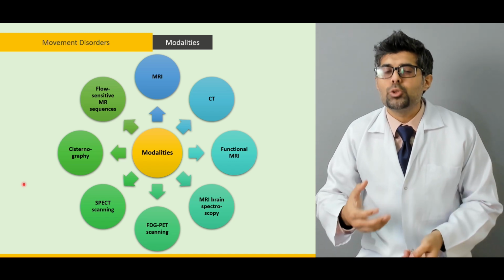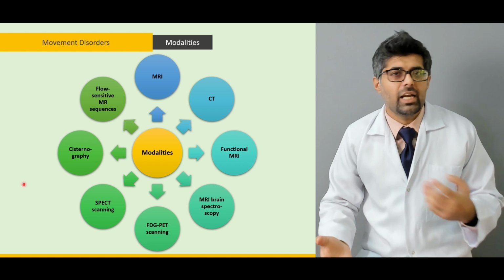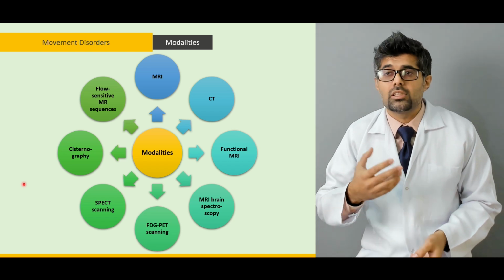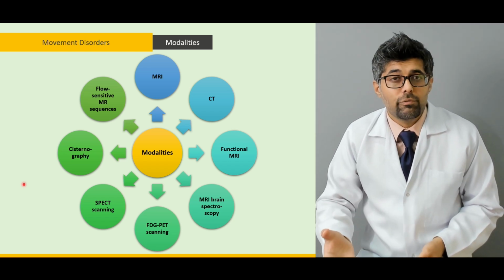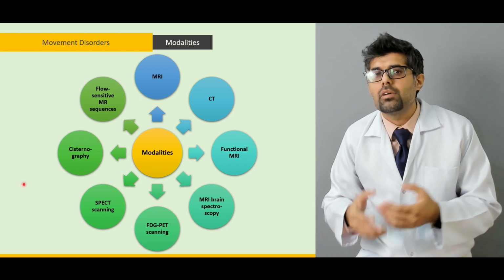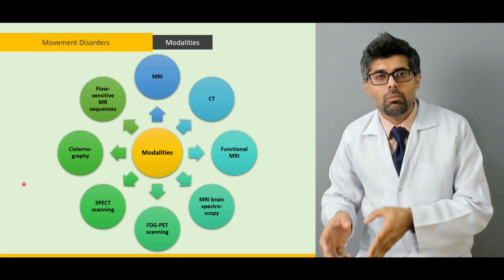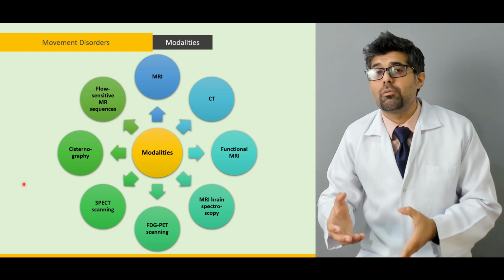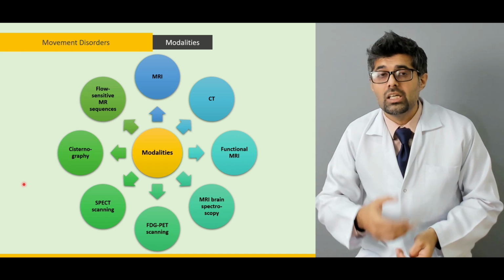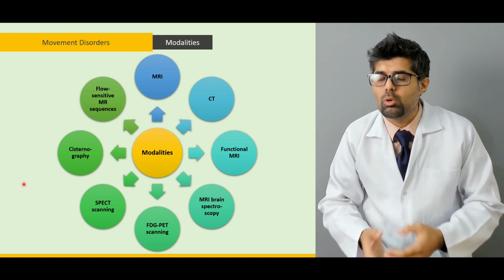Now, usually inside the brain, only two fluids are circulated: blood and CSF. But if there is some kind of edema, if there is some kind of restricted interstitial fluid, then we reserve our study to flow sensitive MRI sequences, because cisternography gives us information on CSF, and the Doppler might give us information on the flow of the blood, but the flow sensitive MR sequences will give us the information on the other fluids, for example the interstitial fluid or the accumulation of one.